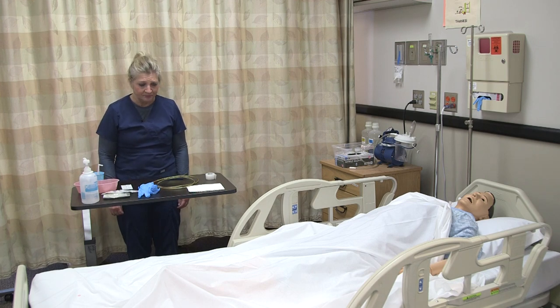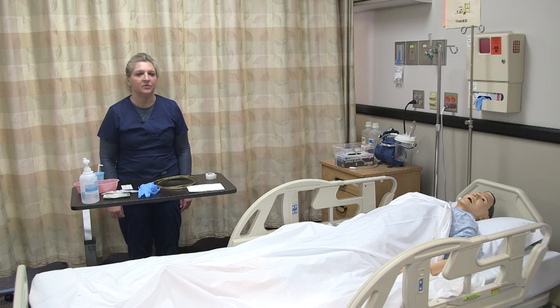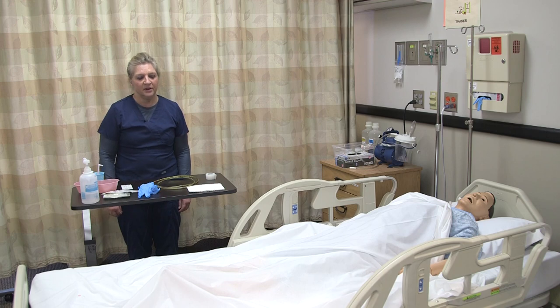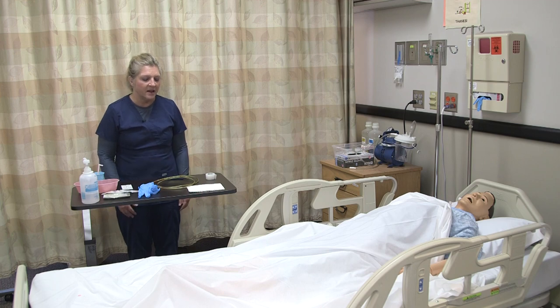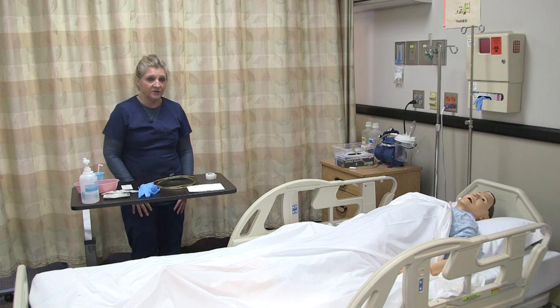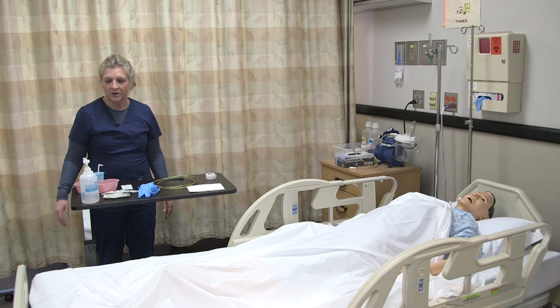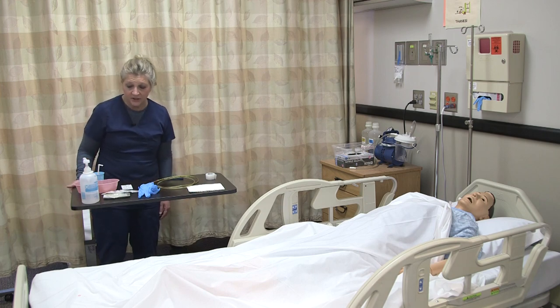I have my patient here who is needing a nasogastric tube. The NG tube is ordered for a bowel obstruction, so the patient is going to have one used for decompression of the stomach, which will also be hooked to suction to help remove any secretions out of the stomach. I verify the patient's prescription from the prescribing provider that the NG tube is indeed going to be inserted, and I explain to the patient what I'm doing, why we're doing it, and how they can assist with the procedure if able.